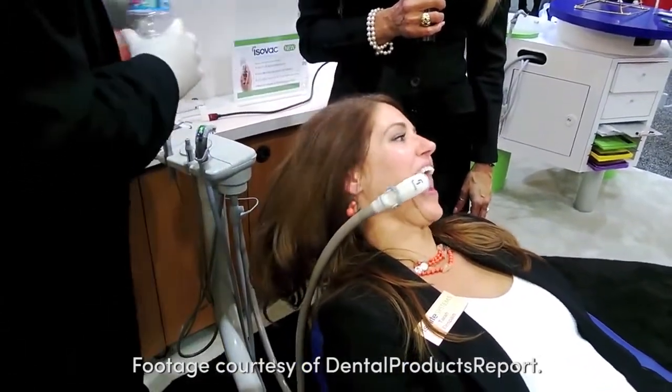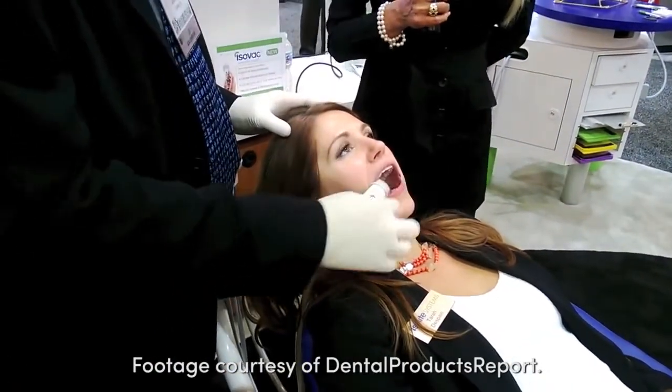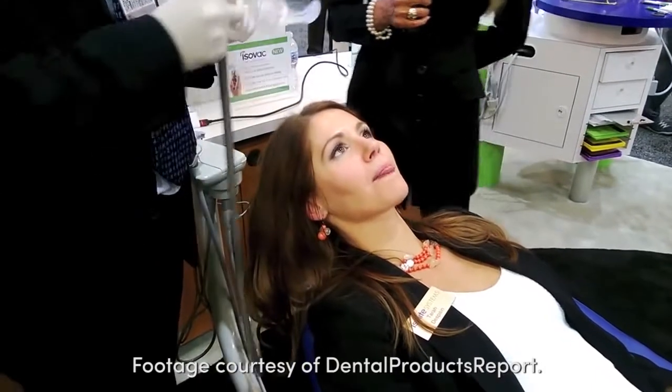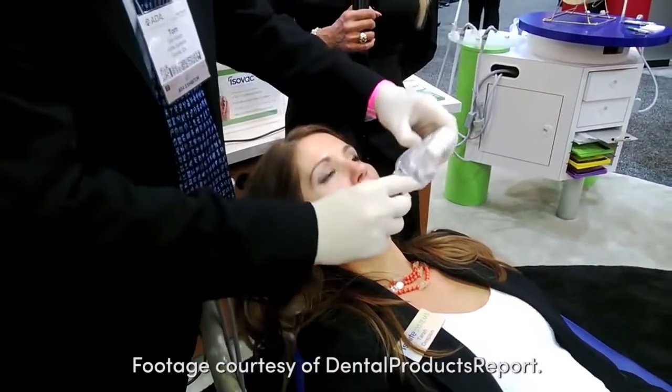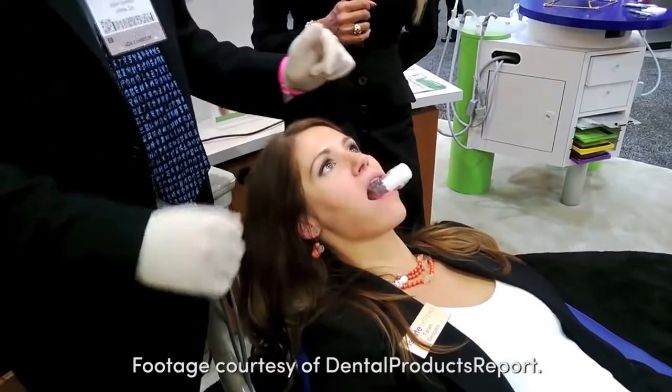This is bilaterally symmetrical, so not only can we work on the left-hand side of the mouth — just by taking this out and inserting it on the opposite side — we now have total control of the right-hand side as well.